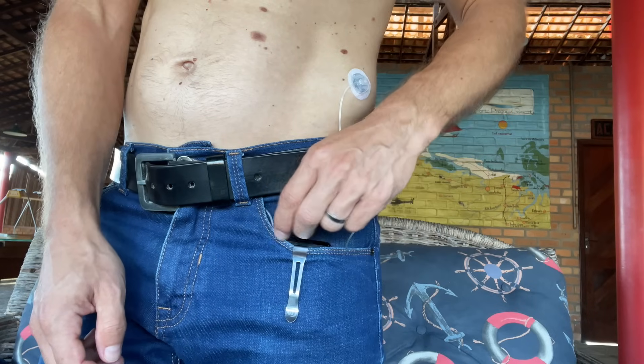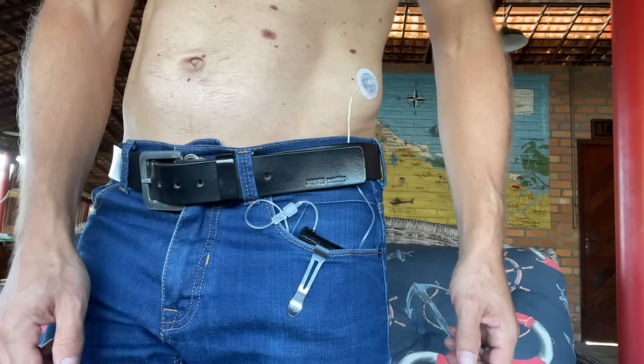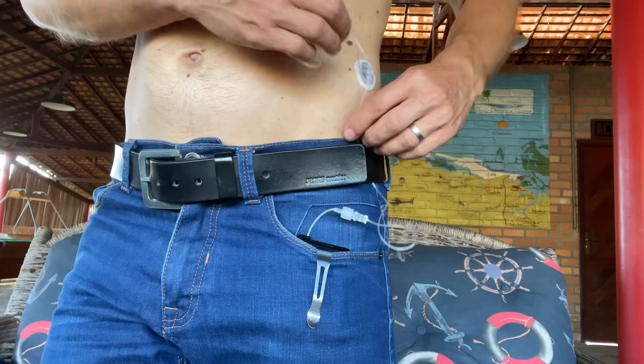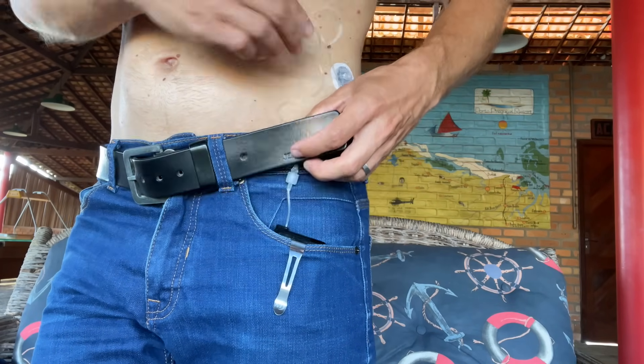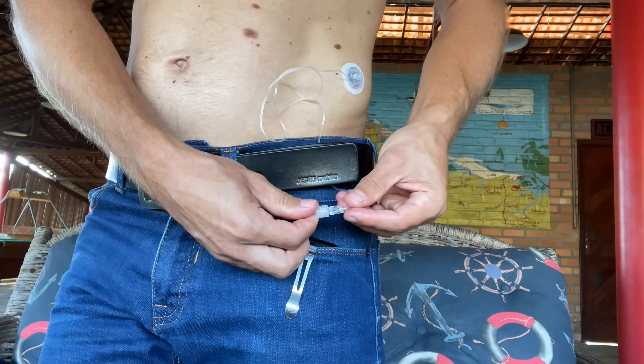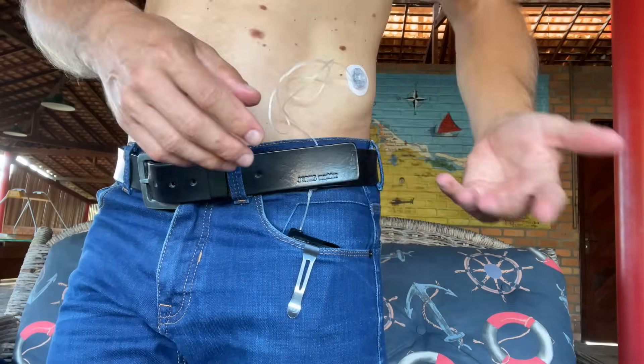Number four is this connector on the tubing, which I honestly hate. It looks so medical and makes your tubing stick out of your pocket. When I wear my pump on a clip in my jeans pocket — my favorite way — I can't tuck the tubing under my belt to hide it because the connector is quite hard and would hurt my hip.